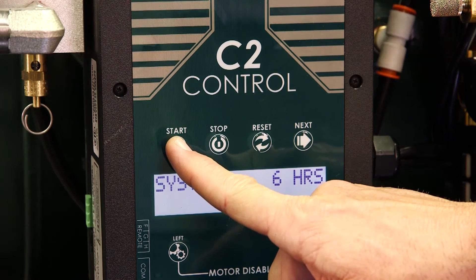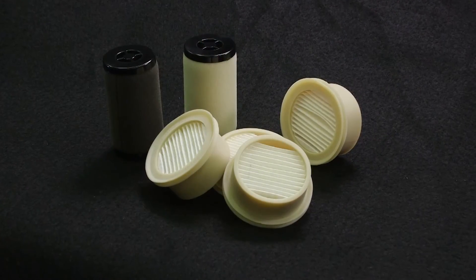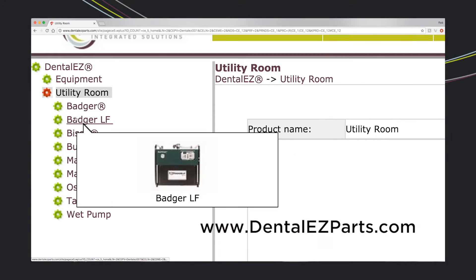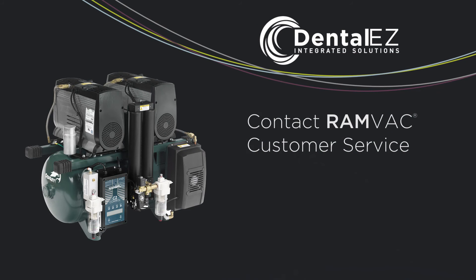Last, return the compressor to service by pushing the start button. We have filters and other parts available. Use DentalEaseParts.com to find a part number for the items you need. For more information, contact RamVac Customer Service or visit www.DentalEase.com.